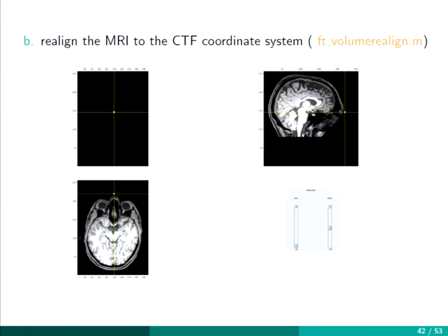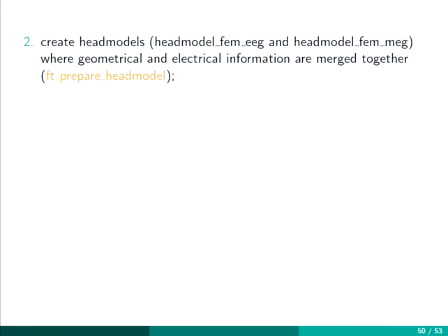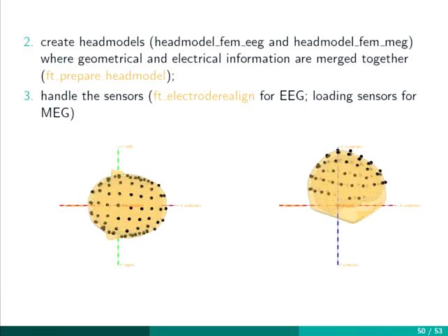But putting the question from another perspective, do you have a way to validate whether this alignment is satisfactory for your model? So once you do this step for the first time, do you understand that this matches within the two spaces? Well, for example, here there's a visualization.